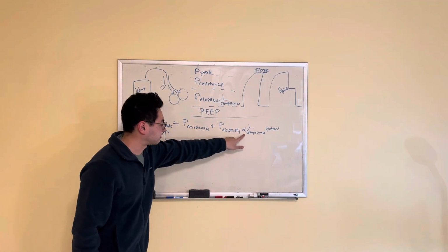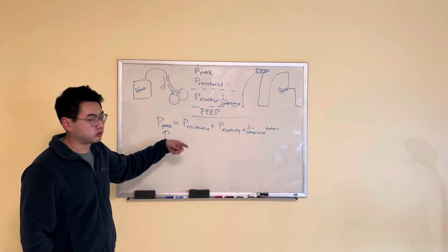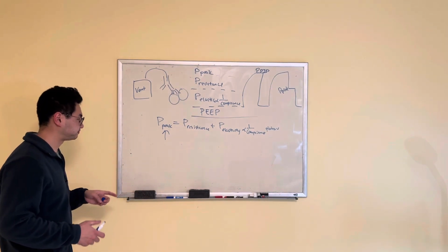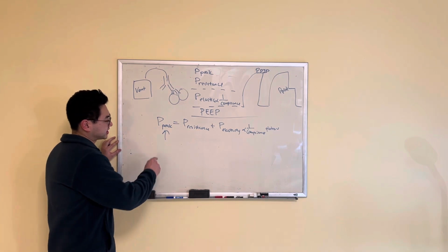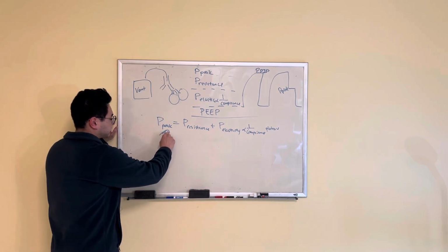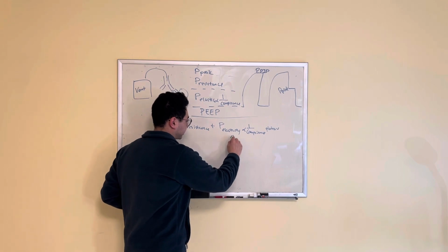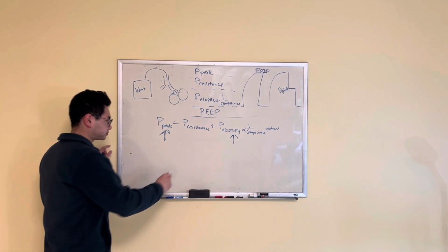If the peak pressure is elevated and the resistance is elevated, we know that the compliance is normal. So what we see on the ventilator is the plateau pressure. It'll be normal. So then we're ruling out a compliance problem and thinking this is a resistance problem. So let's go into that, right? Let's say we're thinking this is a compliance problem. What we would see is an elevated peak pressure. We would get called for it, and we would also have an elevated plateau pressure as well.